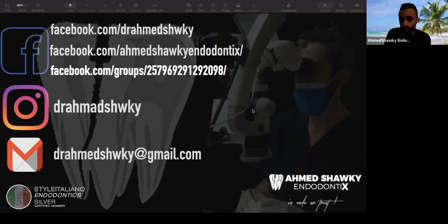So you don't have to use it, but if you decided to use carrier-based obturation, the case selection for this is like severely dilacerated canals, where I cannot apply the classic warm vertical compaction. So I have the option of warm hydraulic condensation, or I have the option of a carrier-based. In these cases, where carrier-based obturation is indicated, I can use bioceramic sealers, of course, but it is not an obligation.